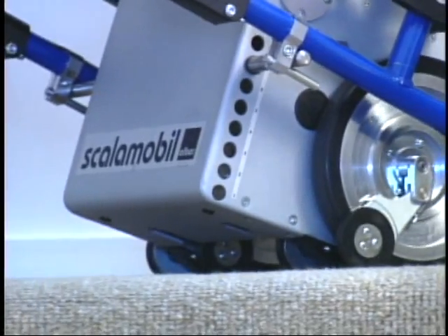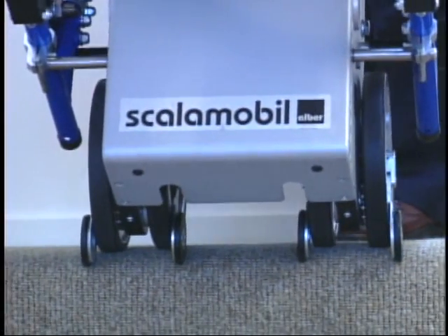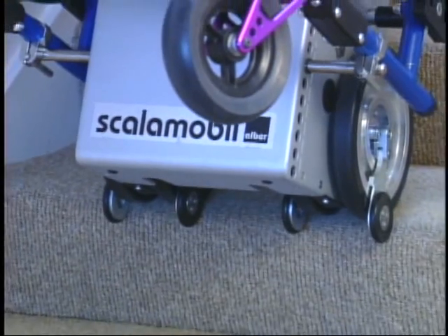The Scalamobil is equipped with a safety brake on each wheel. The brake wheels drop over the edge of the step and the brake lever locks the wheel.